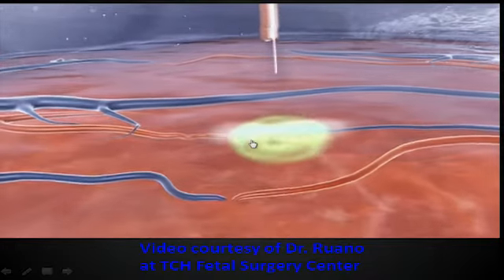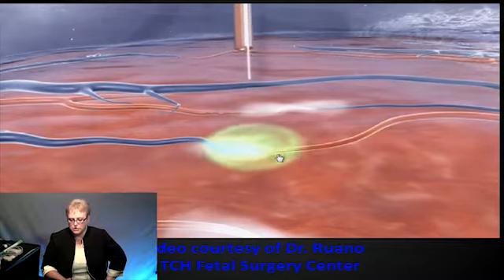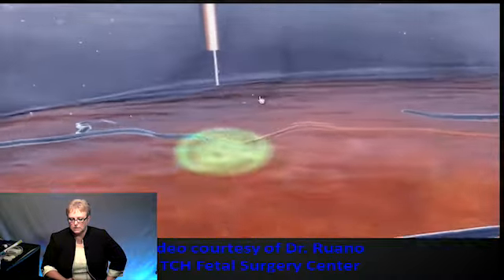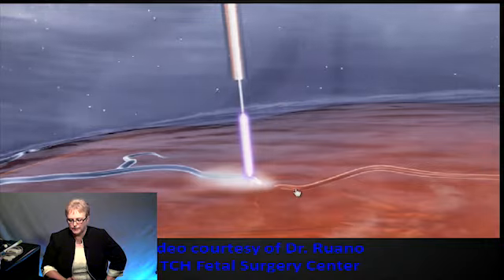So this is venous to artery, venous to arterial. So you can see these little lines. We'll do this one too, venous to arterial.